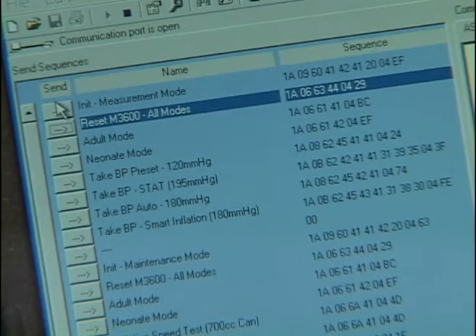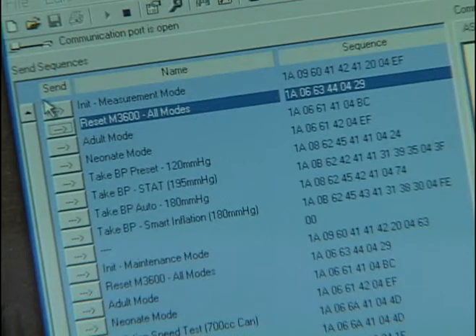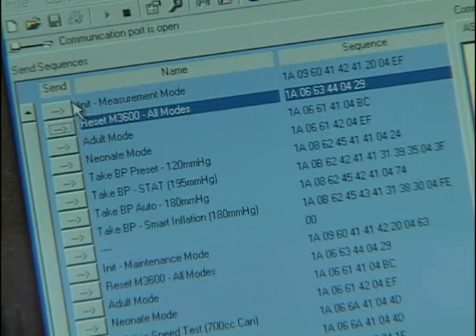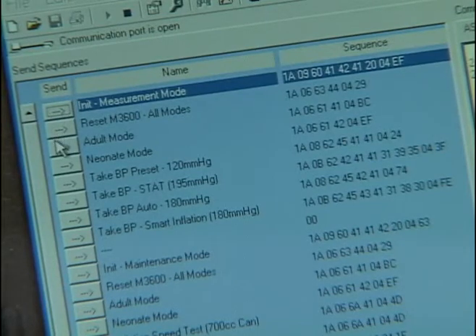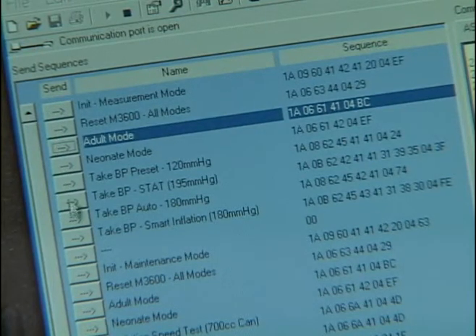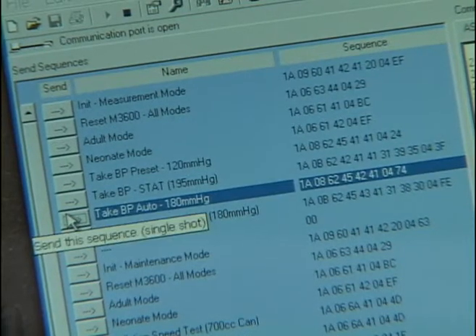What you're looking at is our script program that's included with the developer's kit. In order to get the script to work, you first initialize the module. Then you select whether or not you want to measure an adult, a pediatric, or a neonate. After you've selected that, you tell the module to actually take the measurement by pressing take BP module.